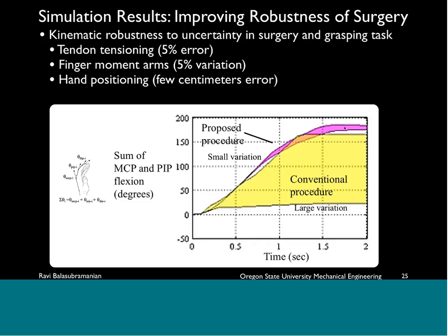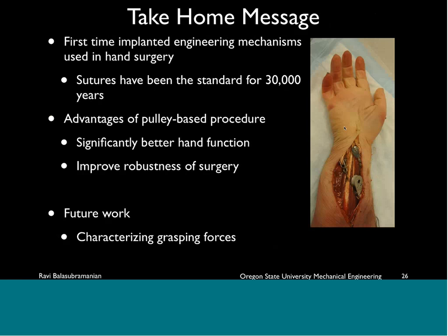Okay, now with this I am ready to give you a take-home message for my talk. So this is the first time that implanted engineering mechanisms have been proposed for hand surgery, and the first time that somebody has done studies in simulation and cadavers.